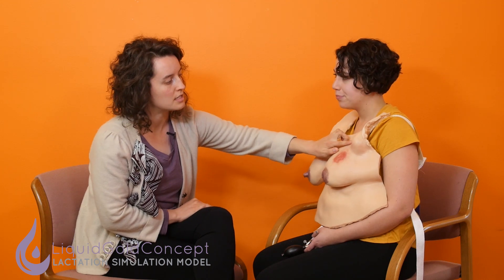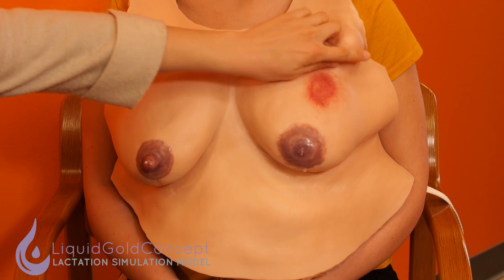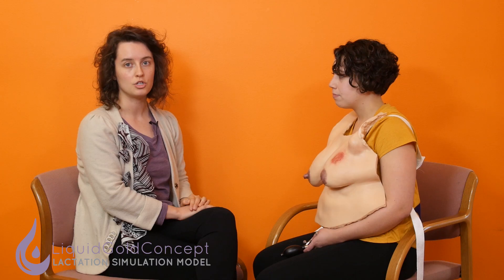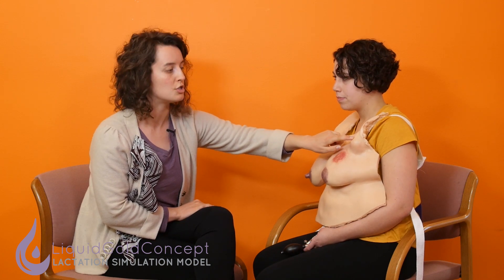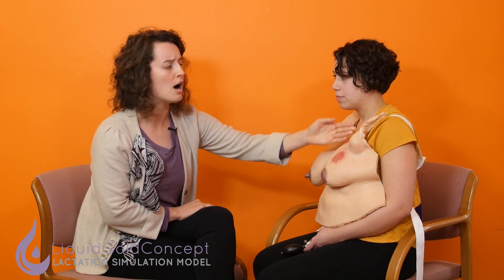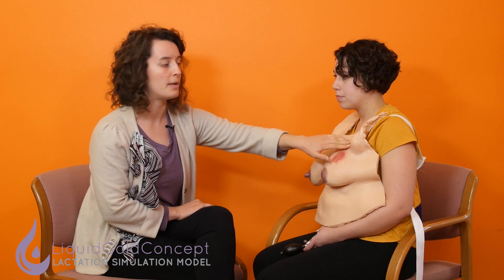Another really interesting feature of the Advanced LSM is ectopic breast tissue. For your learners it will be really important to talk about how to manage ectopic tissue, how common it is, and whether or not it has a punctum, nipple, or areola on it. On our LSM we chose not to put a lactation circuit into the ectopic tissue, but you can definitely develop a case scenario where you ask your students what's happening with this ectopic tissue — is there going to be milk forming in here, and how do you treat it?